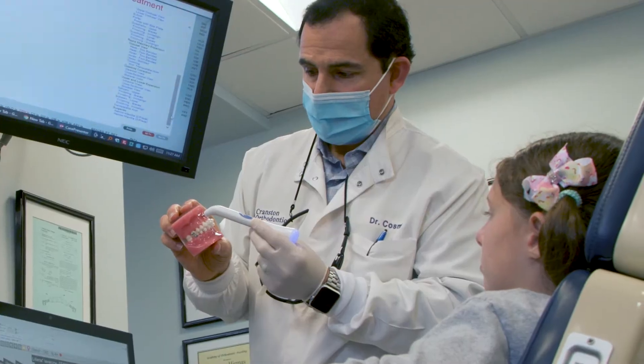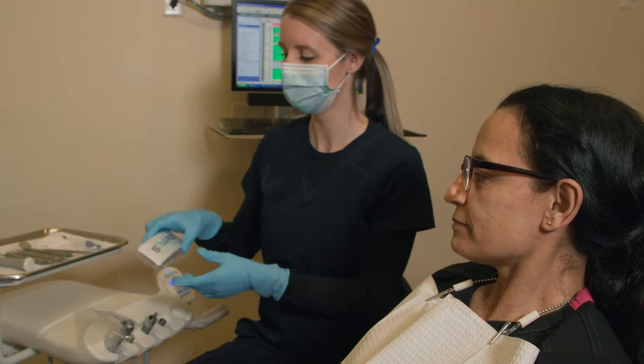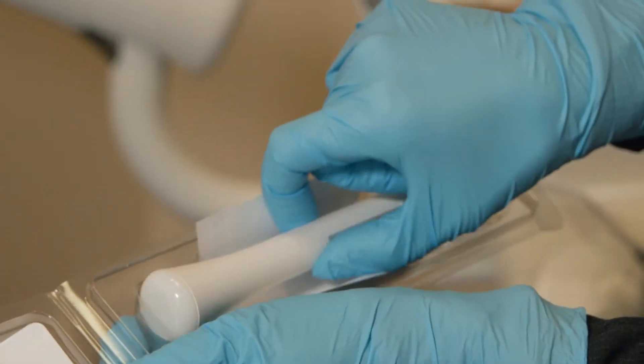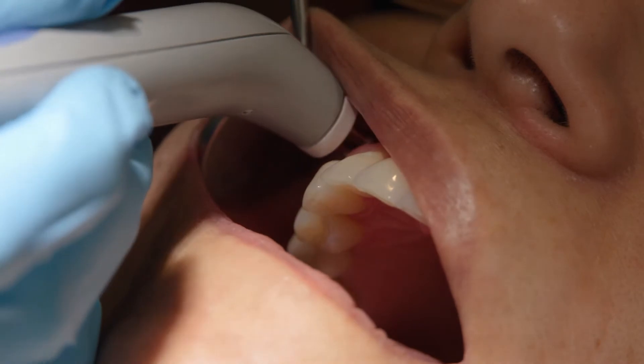This device is a real game-changer. It's a safe and effective way for pain relief both in the office and at home. The Dental Pain Eraser has been a game-changer for me — it has allowed me to minimize the amount of stress I feel when a patient comes in with nondescript pain, a pain that I can't pinpoint.